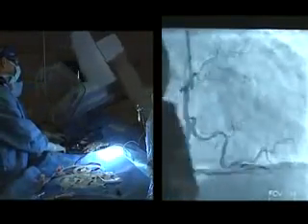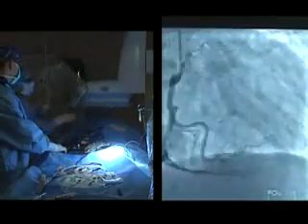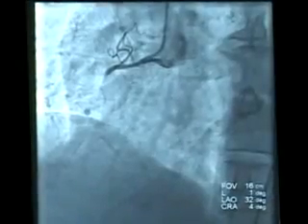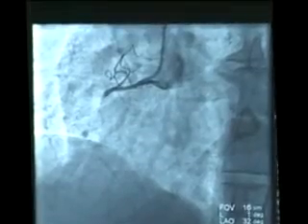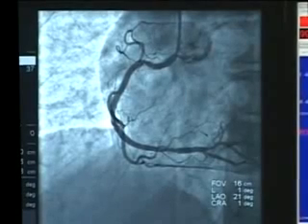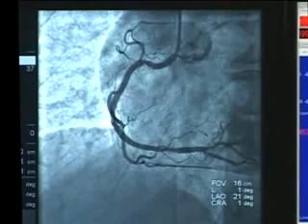And we're finished. Both stents are deployed. The artery's wide open. The flow is excellent. And his heart attack is aborted. So that's the artery before we started. And the top is the artery following thrombus removal, balloon angioplasty, and finally intracoronary stenting of the vessel. So it's actually a large vessel. They can be sometimes deceiving. Looks small when we started, but it's a very large vessel.